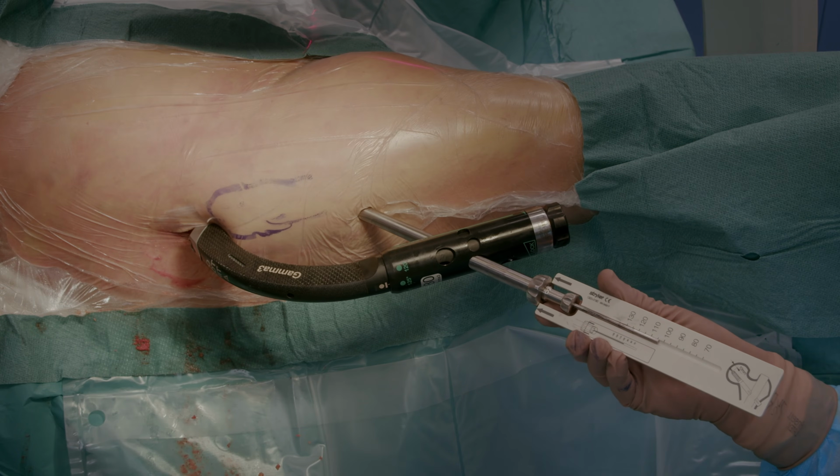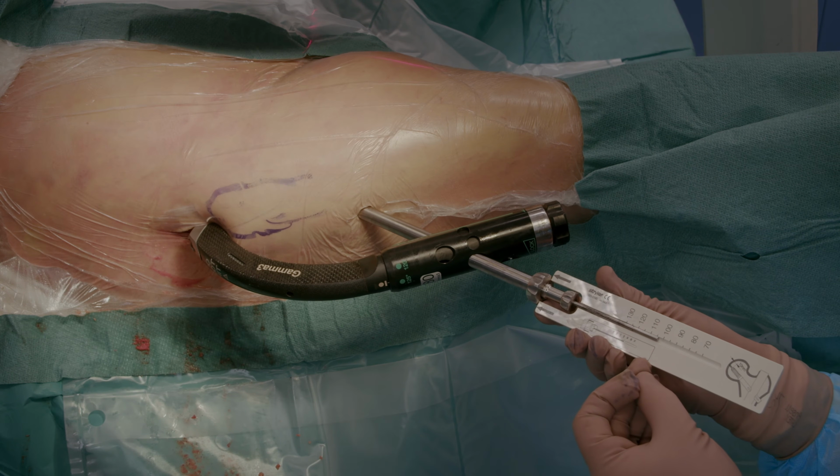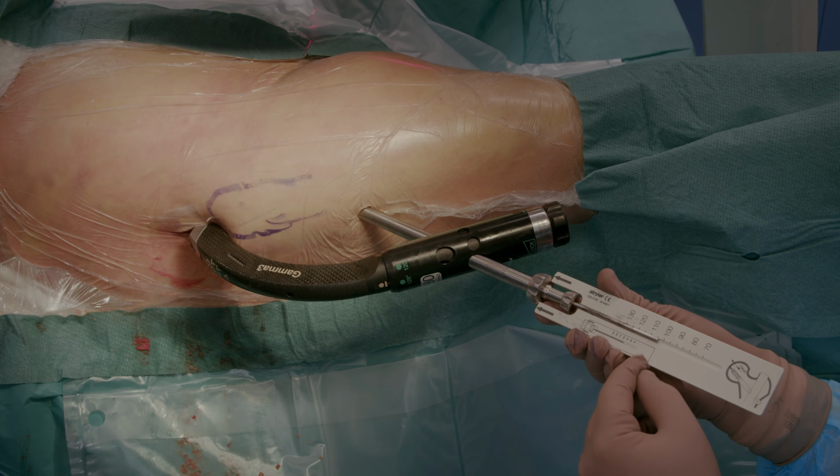Now we measure the length of the lag screw. The scale now shows 103 millimeters. As you can see in these instructions as well, the measuring device automatically subtracts 10 millimeters from the guide wire length. Now, since I have inserted the guide wire a few millimeters below the cortex, I will round the measurement up to the higher reading, so we select a 105 millimeter lag screw.